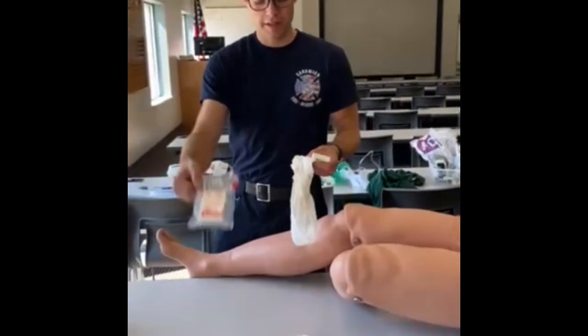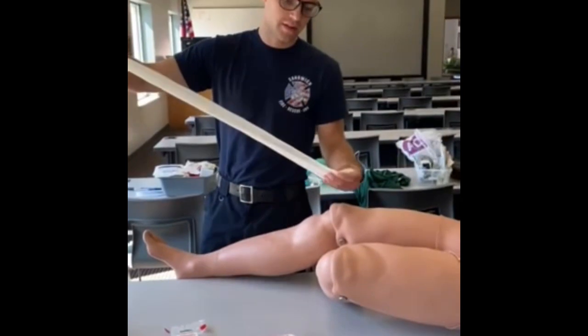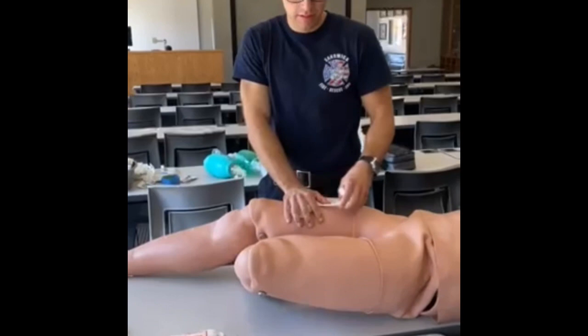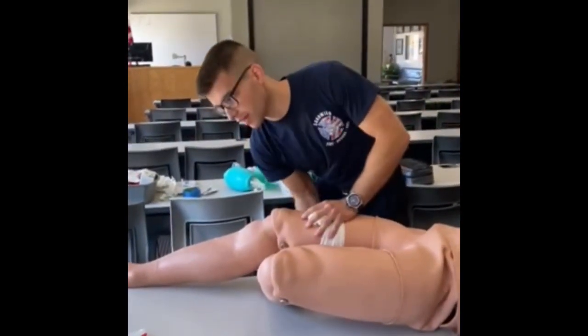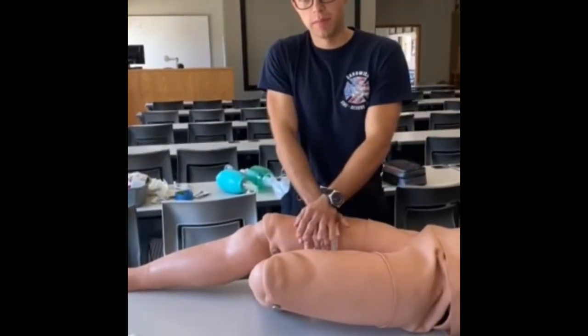Here we have the compressed gauze. Once you open it, it unrolls like so. It can be bunched up and used to apply direct pressure on a wound, and then wrapped as well. It's rolled just like the other rolled gauze shown earlier, and then direct pressure can be applied.